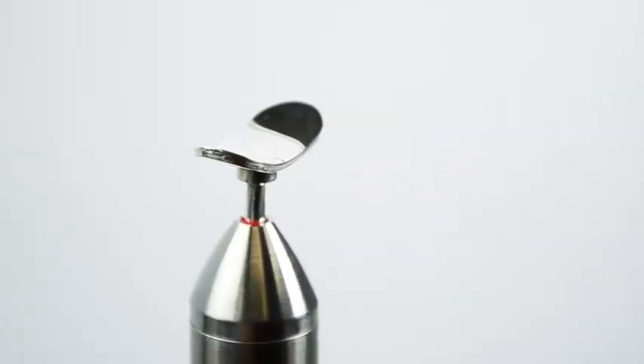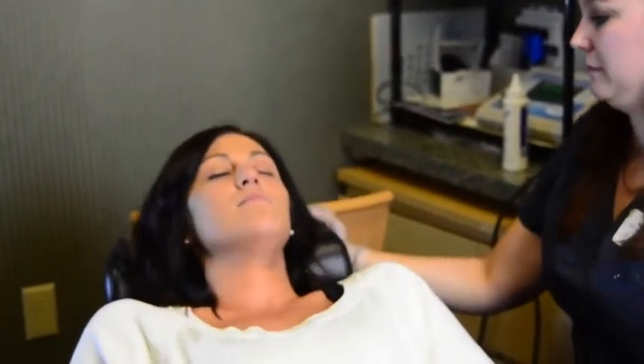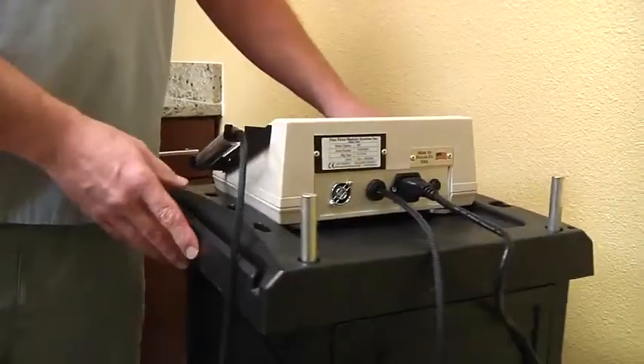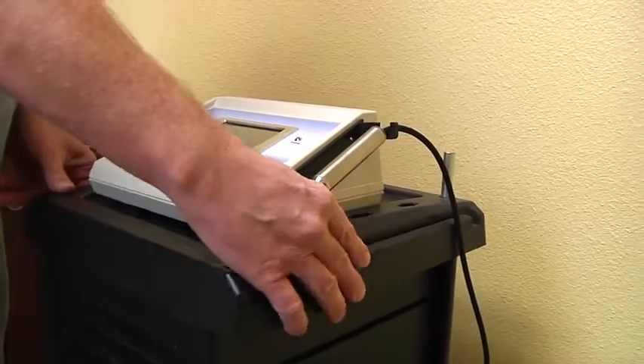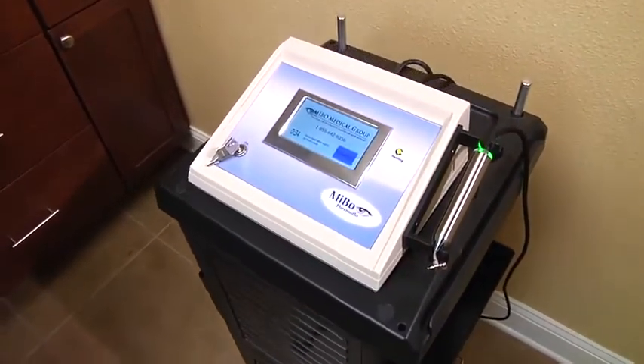The angle of the iPad allows you to hold the handpiece from either position. Placing the chair in a 45-degree or lower position will make it more comfortable for the patient and be easier on the technician during treatment. Place the MIBO on a flat, stable surface within reach to control the touch screen.